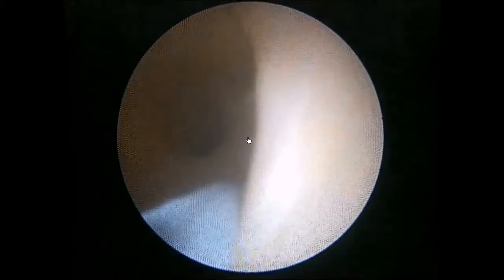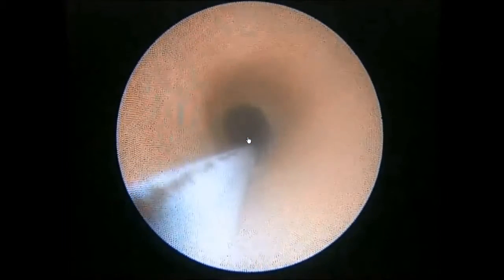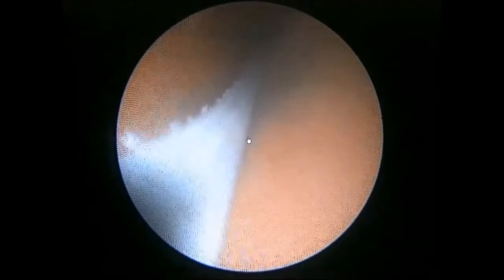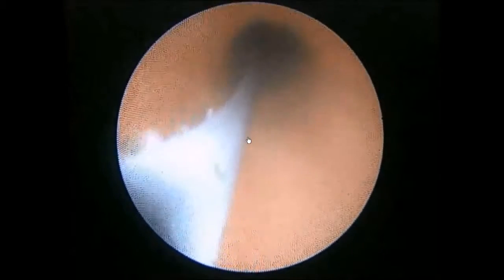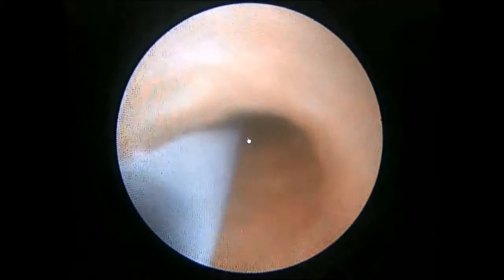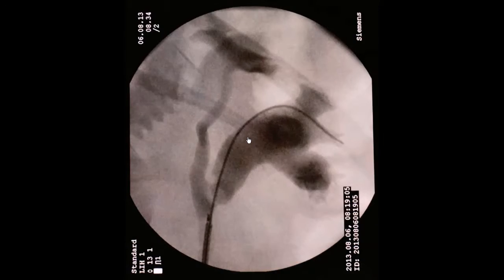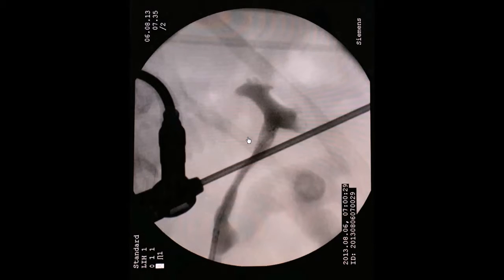We reach the collecting system, but no stone is identified, so we retrieve the ureteroscope. We then perform intraoperative retrograde pyelography, and the stone is found in the lower collecting system of the duplex kidney.